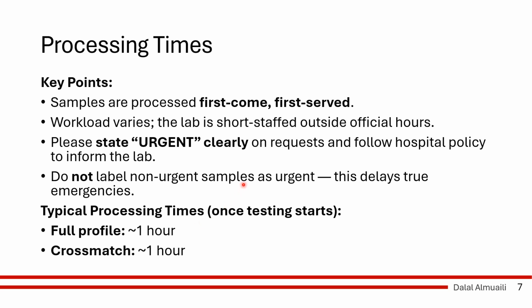Processing time. Now, in most hospitals around the world, samples are processed on a first come, first served basis. The workload will vary and the labs will be short staffed outside of official hours. So if the test takes 1 hour during official working hours, it might take longer outside of the official working hours because of staffing. So if you have samples that are urgent, you need to clearly state that the sample processing is urgent, so your samples can skip the line.